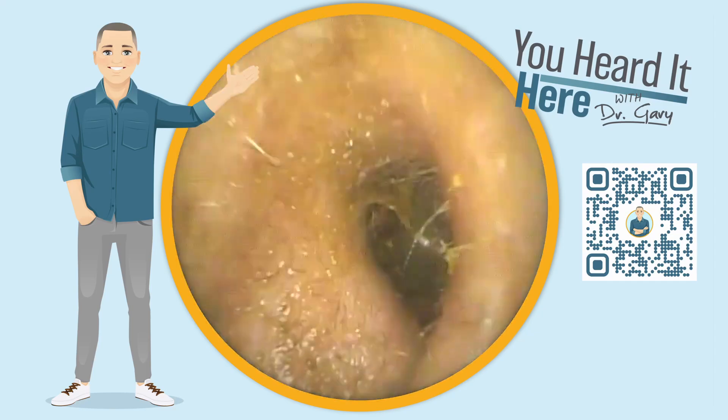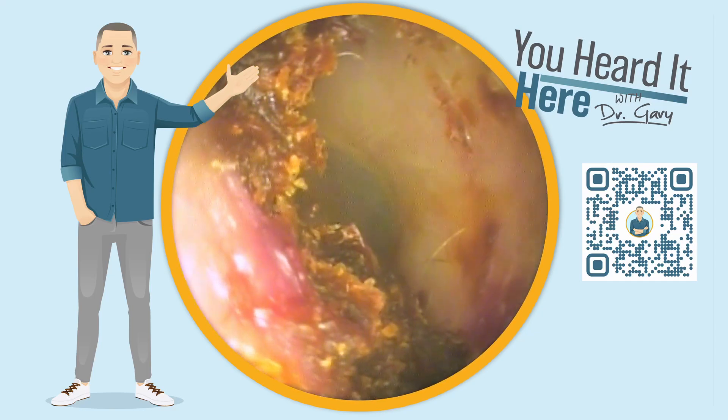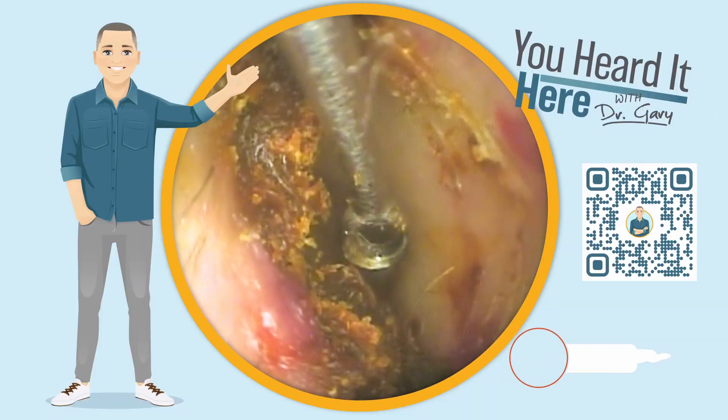I'm going to pull it off the ear canal wall. I'm moving the curette very slowly because we don't want to cause any pain or discomfort for the patient, but we do want to put a constant pressure on that wax to get it to release and remove — hopefully staying in one chunk.